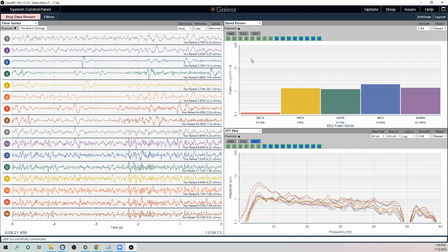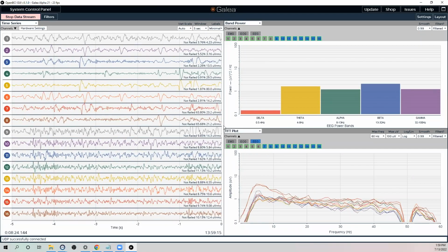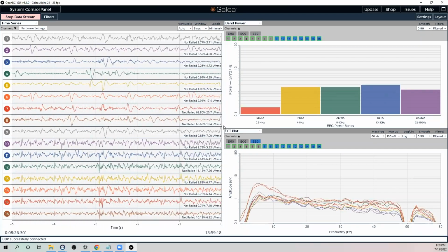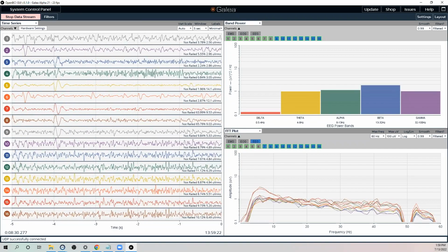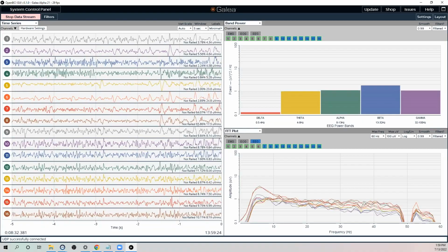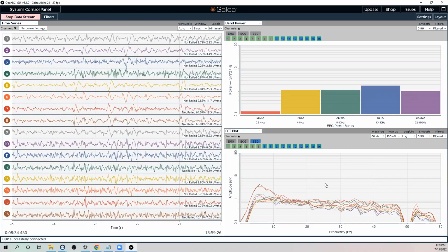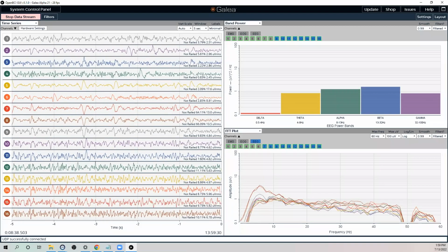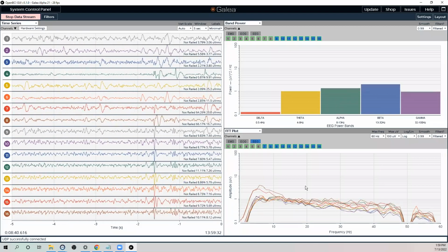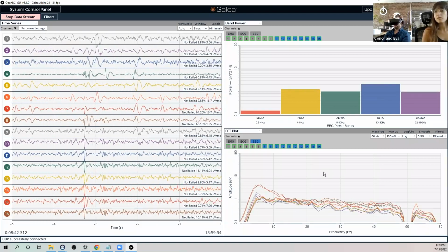So one common question from Nam from Boston: can you forward the raw data through LSL? And maybe you guys could talk through the networking widget a bit more, and also how Galea ties in with LSL today.